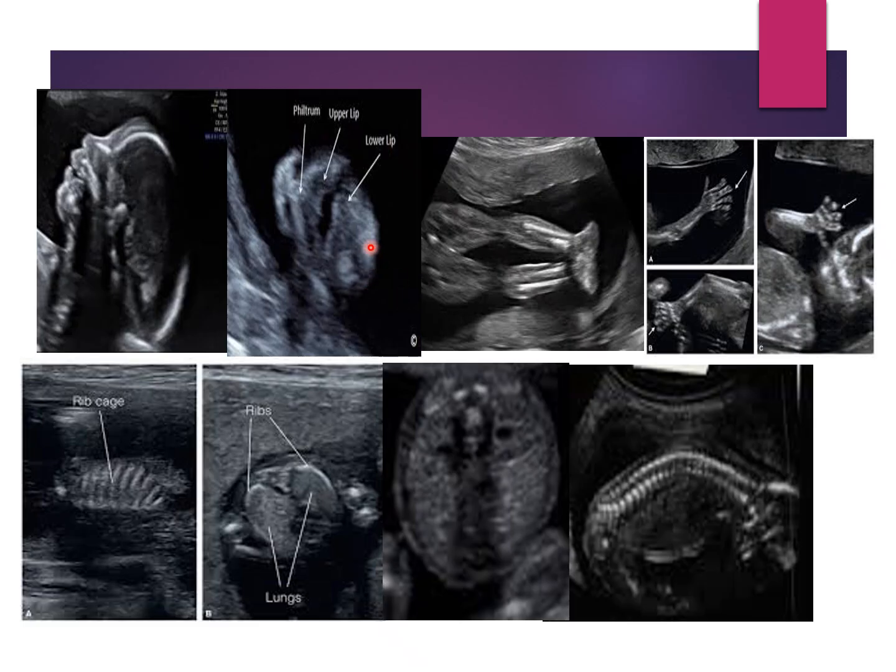Then we're going to come from a coronal approach, looking up into the baby's nose area, and we're still going to see this chin, but we're going to see these lips here. We want to make sure there's no break in the lip going up into this space called the philtrum, and then we have our nose and our two nostrils here and here. This image is required by most MFM sites, so knowing that you're coming up from an underneath view of their lips, kind of a coronal view there.